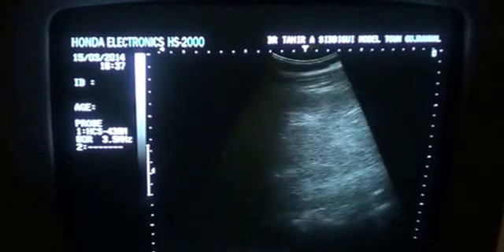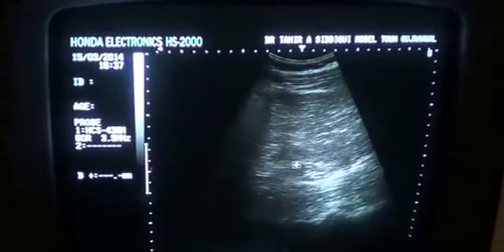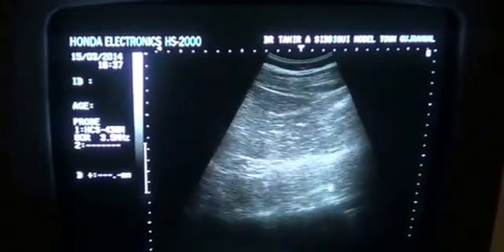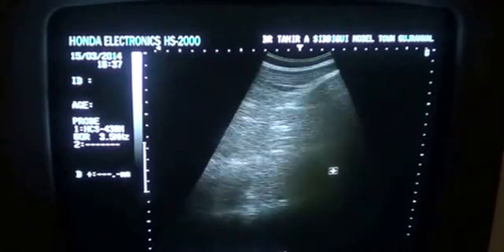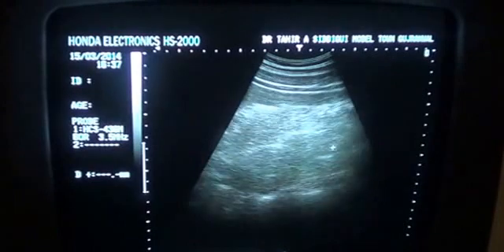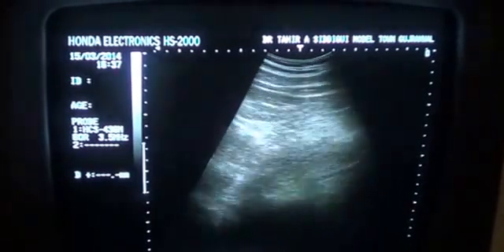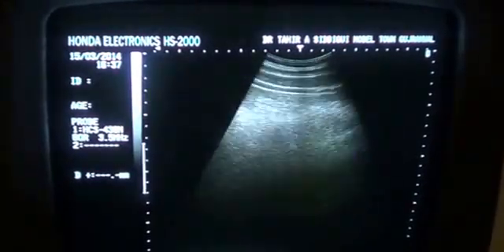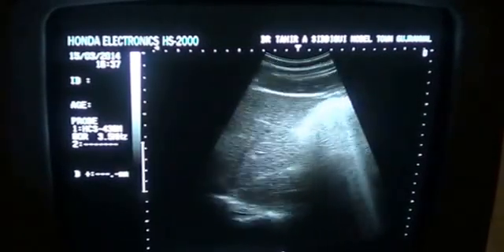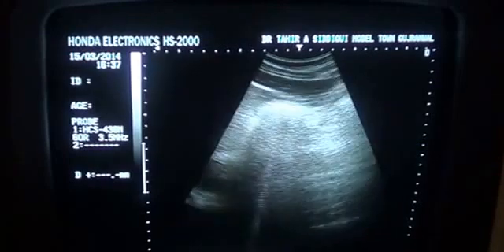Now what about the psoas muscle in this region? Here you see it again, this is the right iliopsoas muscle strap that is in front of you. Here we come, this is the lower end of the psoas muscle. So no relation with the psoas muscle. What about the para-aortic region? A lot of gas in this region.